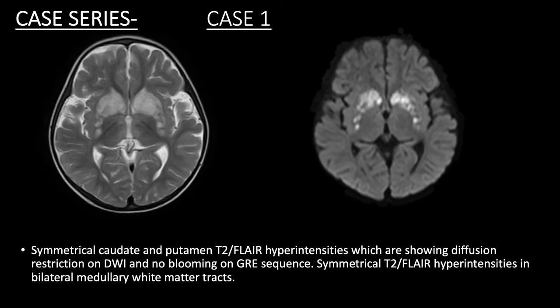Case 1 is of a 2-year-old male patient, which shows caudate and putamen T2 FLAIR hyperintensities with diffusion restriction. Also, there were symmetrical T2 FLAIR hyperintensities in bilateral medullary white matter tracts. There was a double lactate peak in caudate nucleus on MRS.